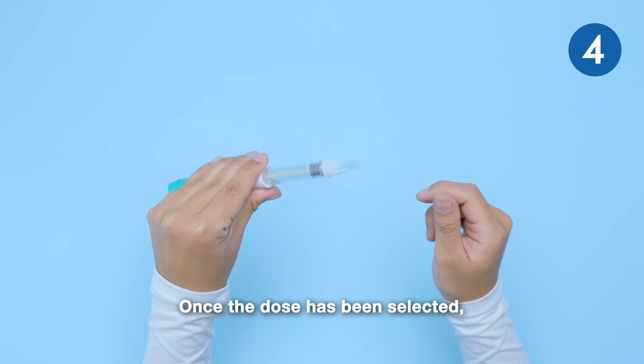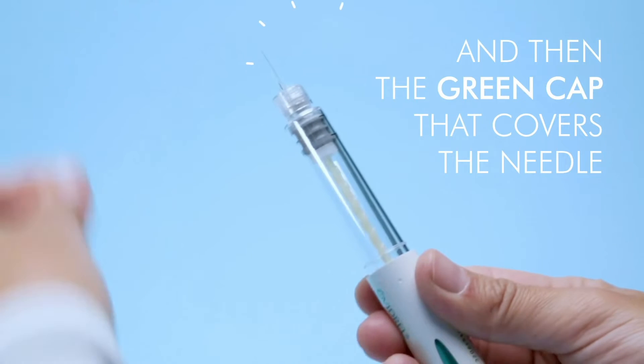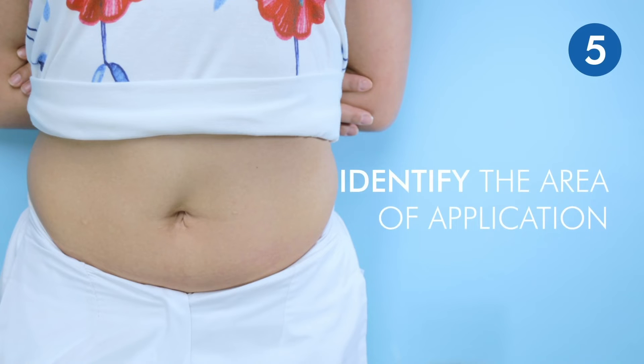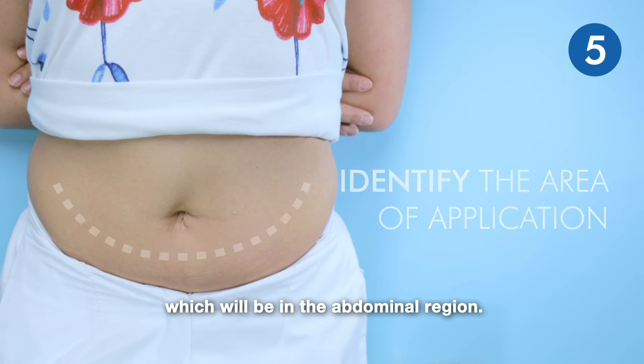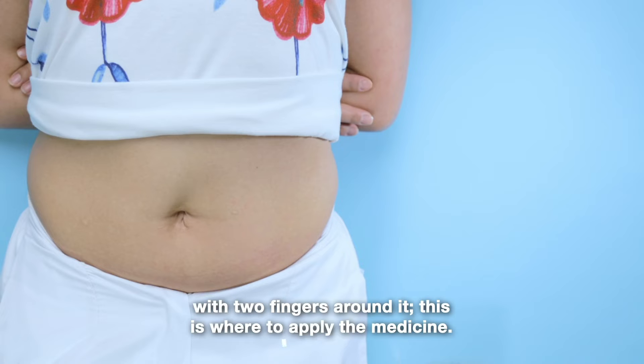Once the dose has been selected, remove the white cap and then the green cap that covers the needle. Identify the area of application, which will be the abdominal region. Take as a reference the navel with two fingers around it — this is where to apply the medicine.